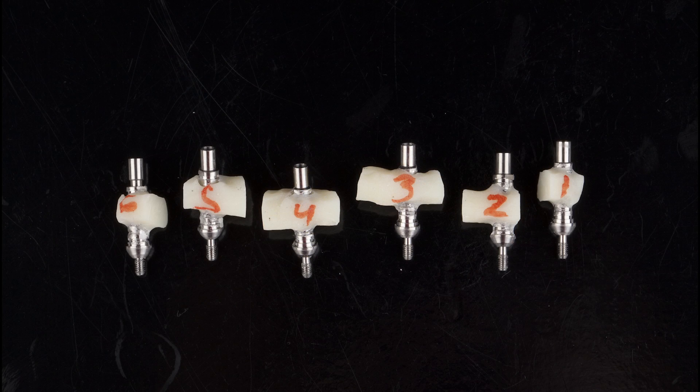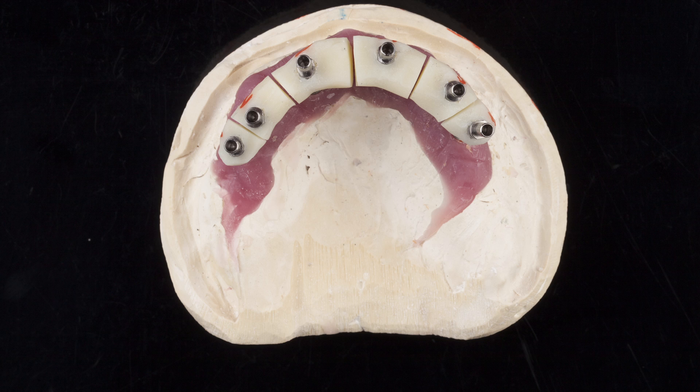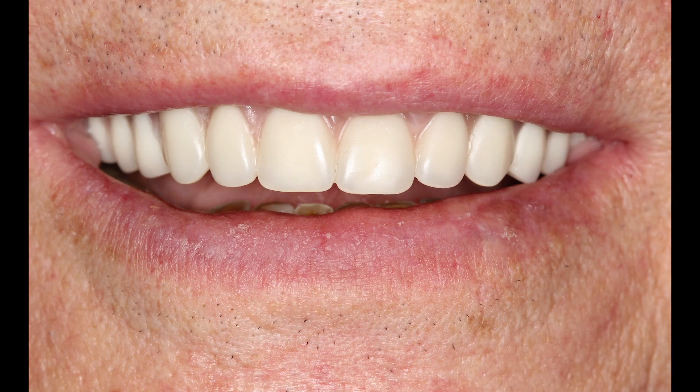To ensure that final milling would position the access holes of the definitive prosthesis in the precise location needed to accommodate the location of the implants, the dental lab fabricated an implant verification jig. A custom impression tray was also produced by the lab and was designed to seat over the individual sections of the verification jig. The wax setup, implant verification jig, and custom tray were sent to the office for the next appointment, when the patient was called in for the wax setup try-in and final impression.